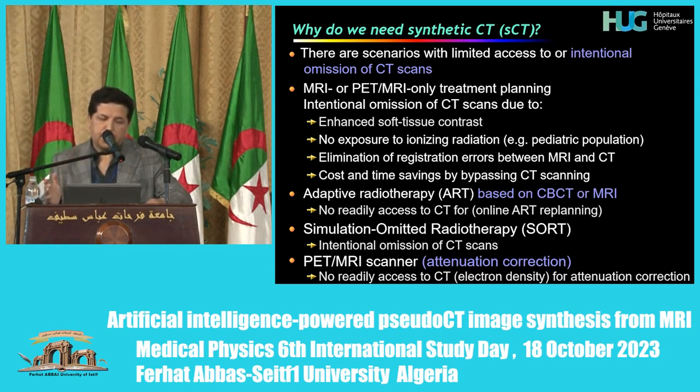It also eliminates the problems that we face with non-rigid alignment or registration between MRI and X-ray CT. There are also financial issues, like cost, and the workflow gets much simplified. This is especially important for adaptive radiotherapy, where we don't have direct access to CT, and CT provides the electron density which is needed for radiation dose calculation, for instance.